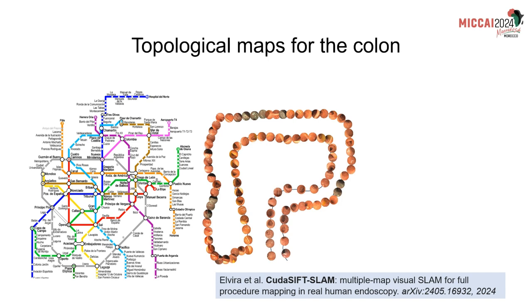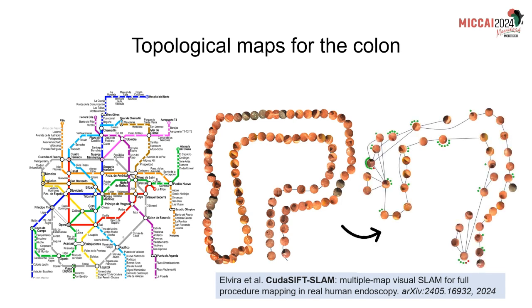What we want to have in colon SLAM is a graph more like this, where all the traversability links represent the complexity of the procedure, and each node is a colon location that groups a lot of submaps that are co-visible between them.